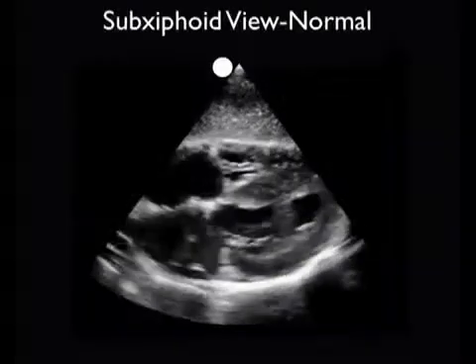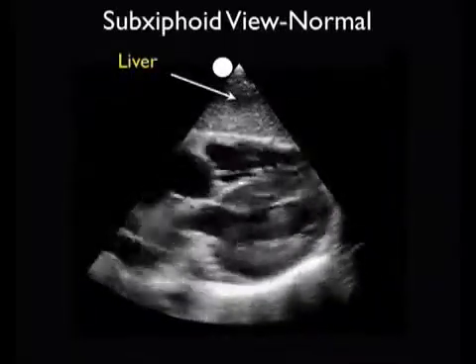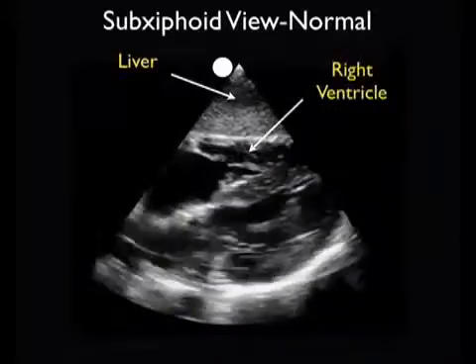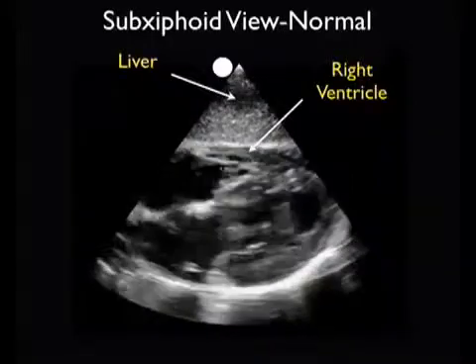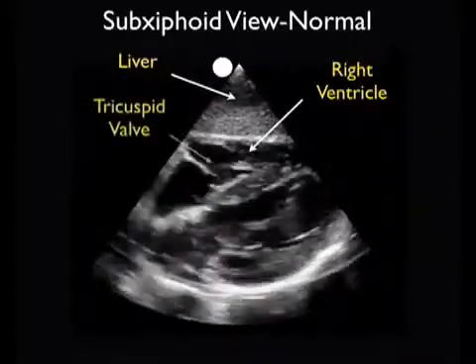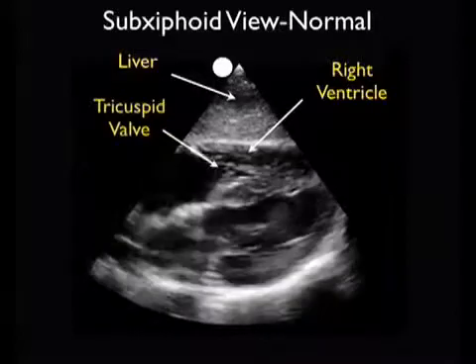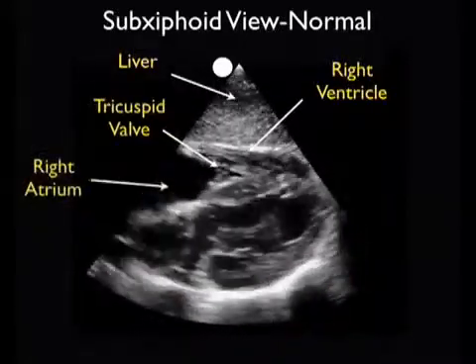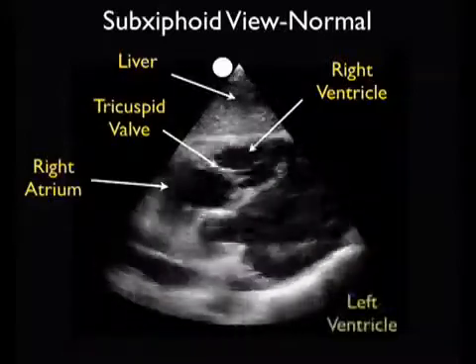Now that we know where the chambers are, let's take a look at a video clip of a normal heart from the subxiphoid plane. The liver is our acoustic window onto the heart from this plane, so the liver will be seen anteriorly just to the top of the screen. Just below the liver, we appreciate the right ventricle, and just to the left of the right ventricle, we can appreciate the right atrium.